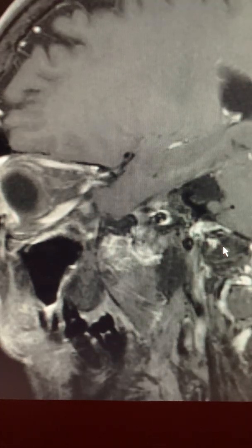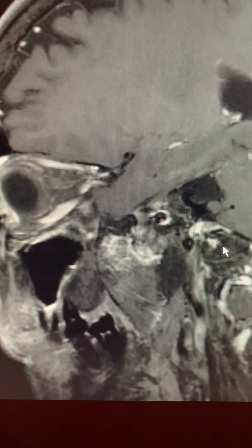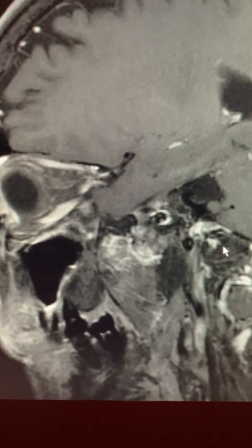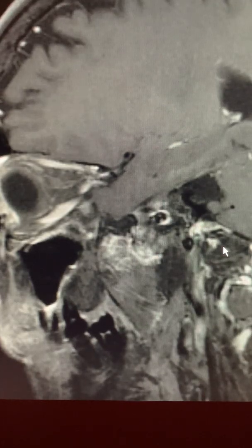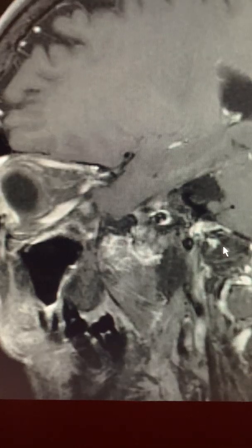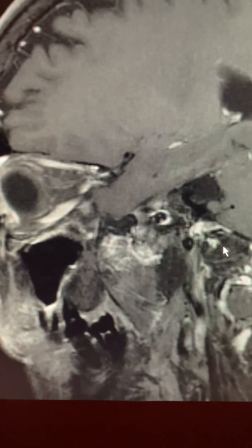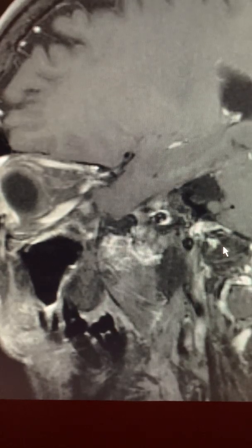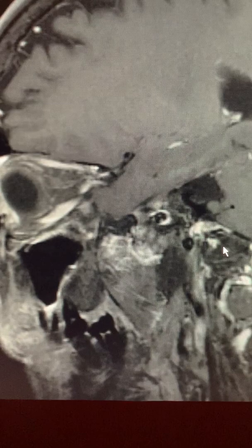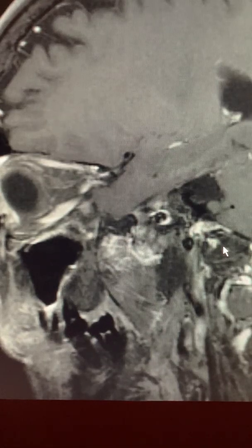This is Dr. Louis Blevins of Pituitary World News, continuing in our series of short videos regarding radiographic findings so that you can learn more about pituitary disorders and also how to interpret MRI films. The patient I'm showing you today is a lady who was referred to us with a diagnosis of a pituitary tumor — her tumor detected when she had an MRI scan done to evaluate migraine headaches.